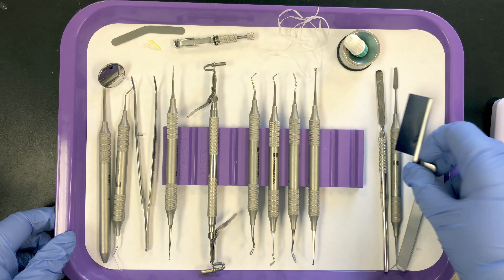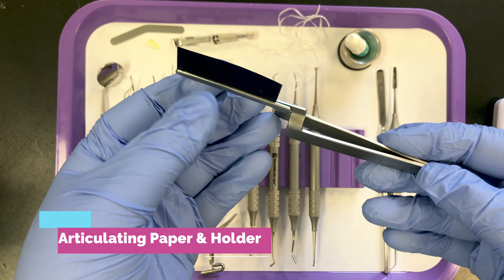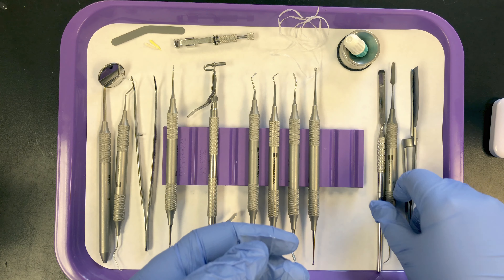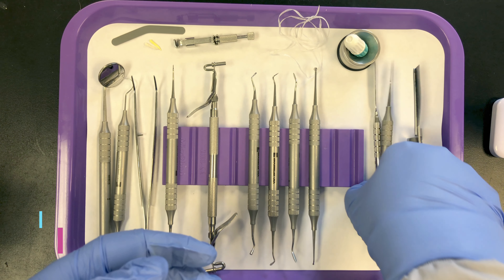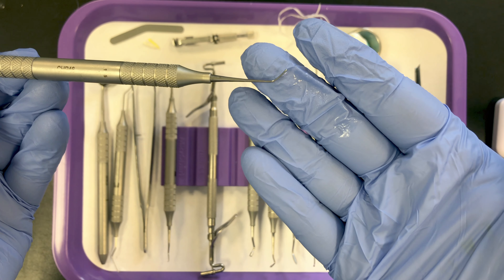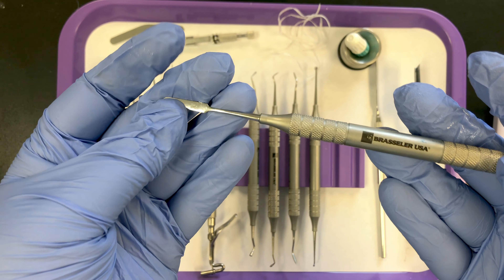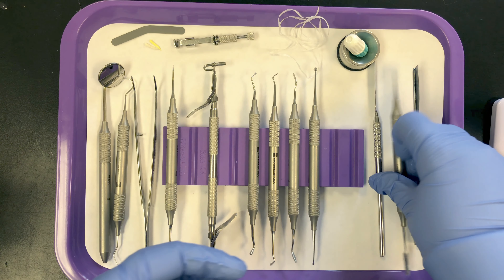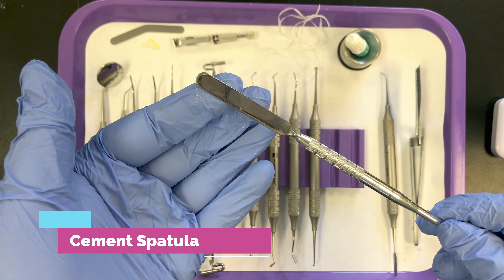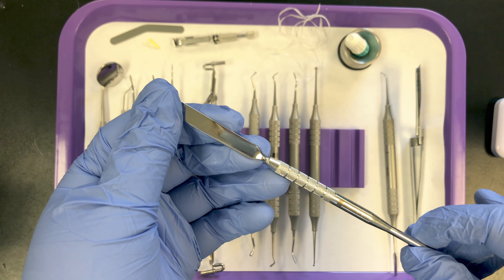The accessory items: we need articulating paper forceps and articulating paper to check the occlusion, checking for any high spots. We also have a diecal placing instrument — this is a combination diecal instrument and spatula to mix any liners or bases that you may need. We also have a cement spatula, though technically not necessary since the diecal instrument already has a spatula.